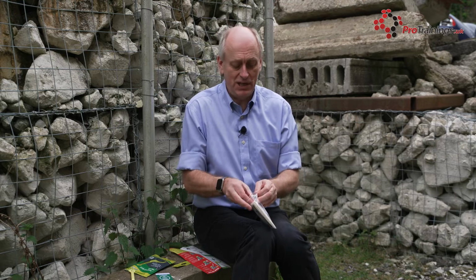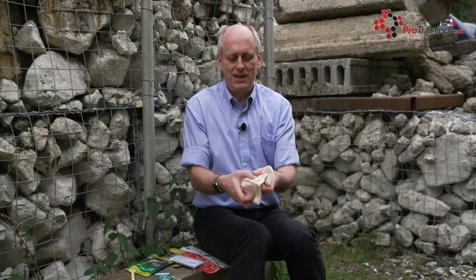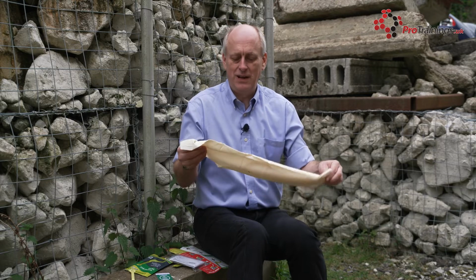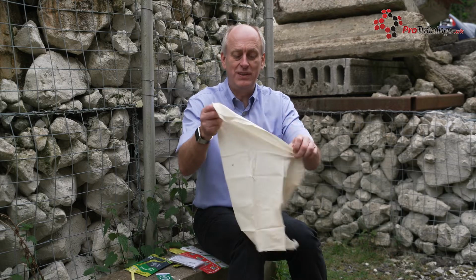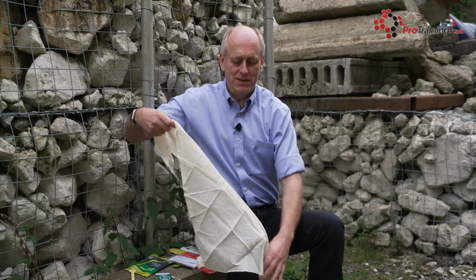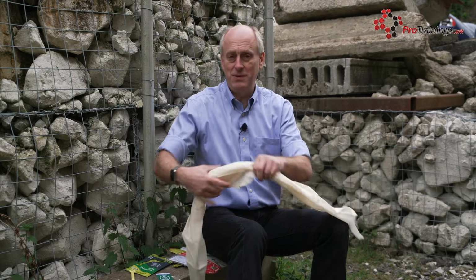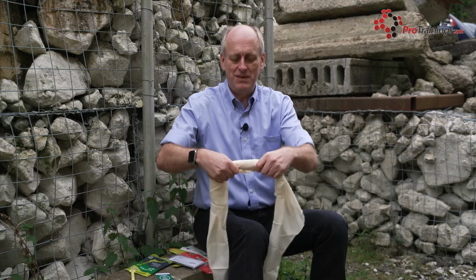Final part is the triangular bandage. This is the material type of triangular bandage. So what you're doing with this is just undoing it, and this is the actual item that will produce the occlusion of the blood. So what you do to start with is just roll it up. There's a nice broad white weave on there because we don't want to have it too tight, because the idea is this is broad across the body.